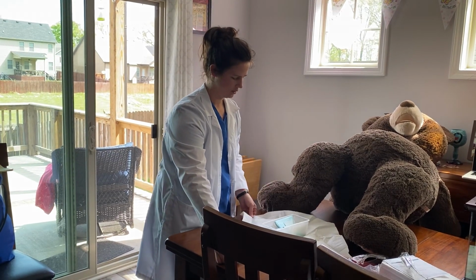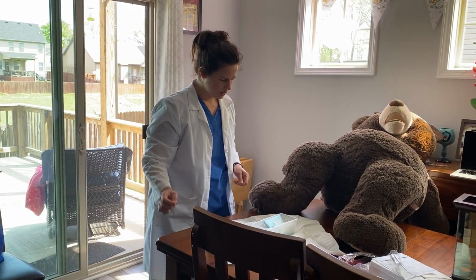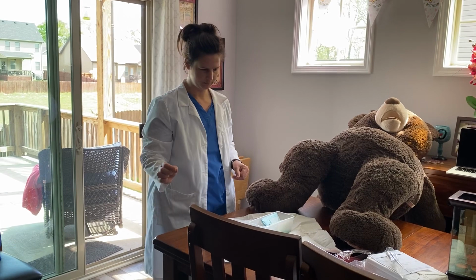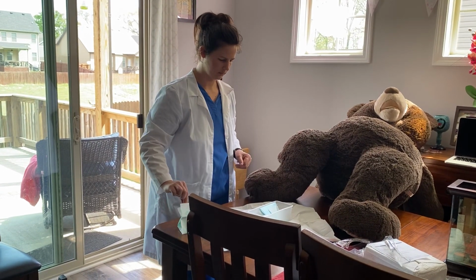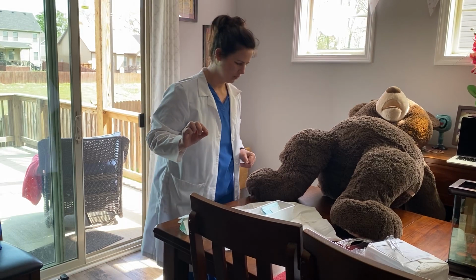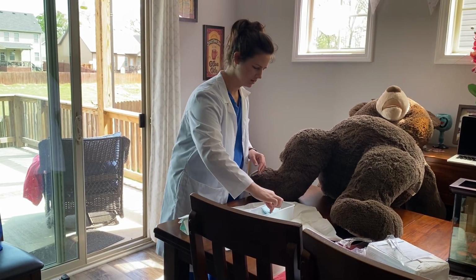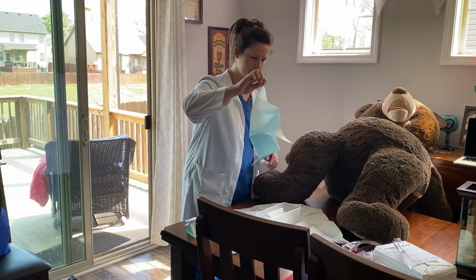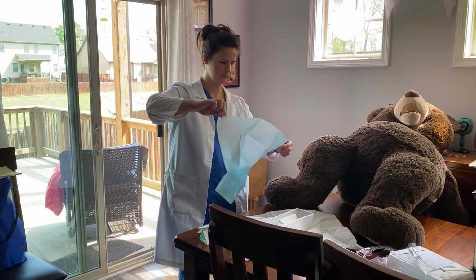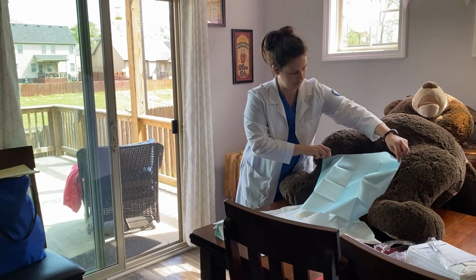Okay, so we have our sterile field here. And I want to grab my sterile gloves out of there and set that off to the side. And then we are also going to grab our drape that we're going to put underneath the buttocks. The shiny side is going to go down. Watching your sterile field here.